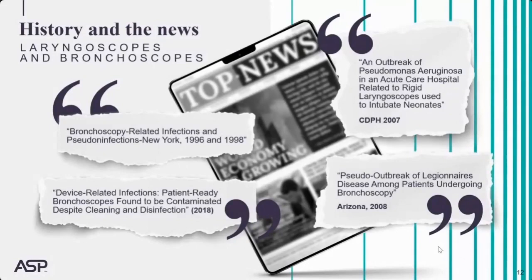In 2007, an outbreak of Pseudomonas aeruginosa in an acute care hospital was related to rigid laryngoscopes used to intubate neonates, which were subjected to cleaning, but no further reprocessing. And it's my understanding that originally they were being reprocessed in SPD, but SPD was losing them. And so respiratory took ownership of them again. And the way they were cleaning them, I believe, was with just some alcohol. So they weren't high-level disinfecting them or sterilizing them.